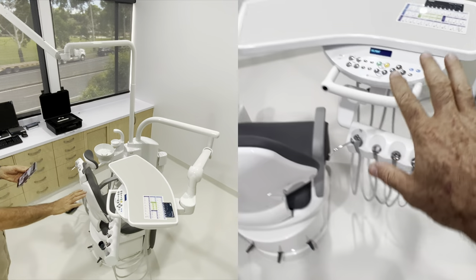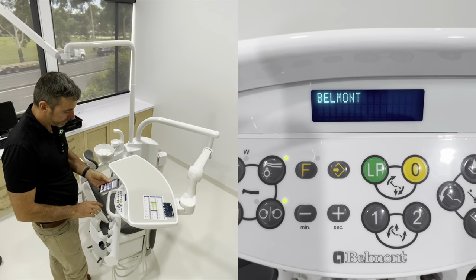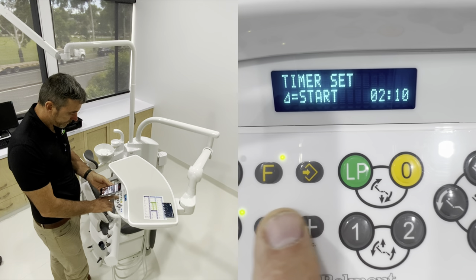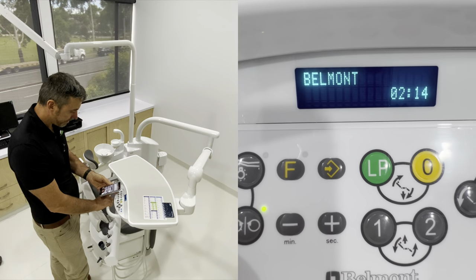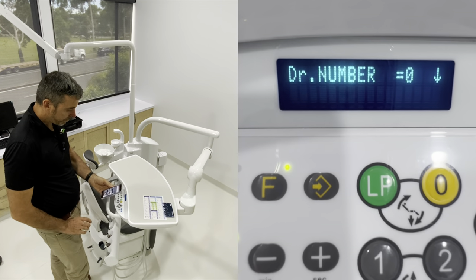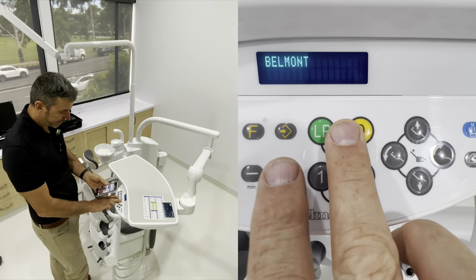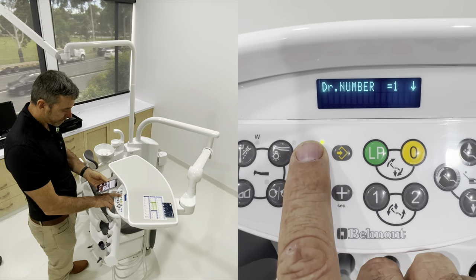Now we're going to deep dive into the functions on here using the F key, which gives a lot of user-settable options. Function one is timer - plus for seconds, minus for minutes, then hit the triangle to start. It counts down on the display. Hit function and stop to cancel. Function two is really good if you've got multiple doctors - you can have doctor zero, one, two and three, giving you four different doctor presets. Each doctor preset will remember all of your water settings, speed settings, and chair presets.